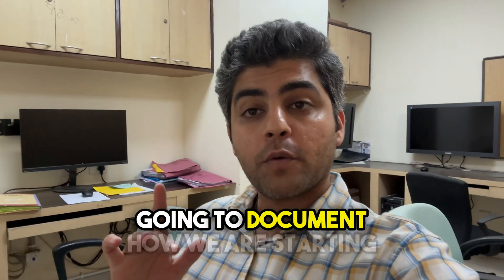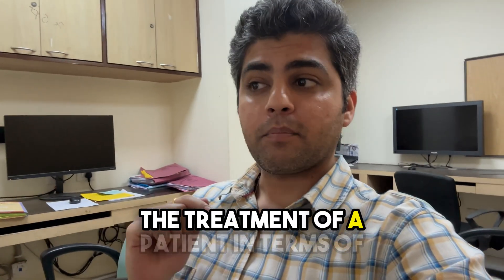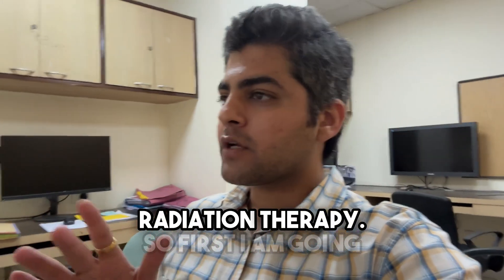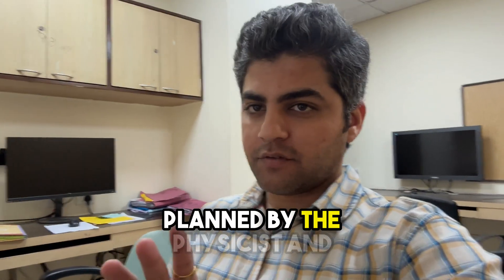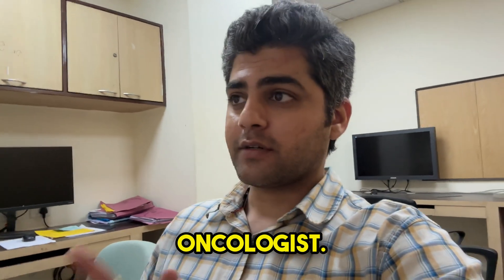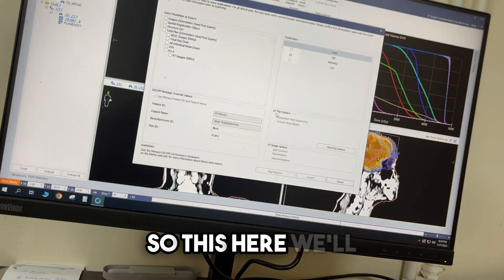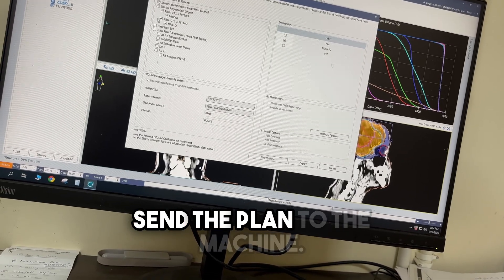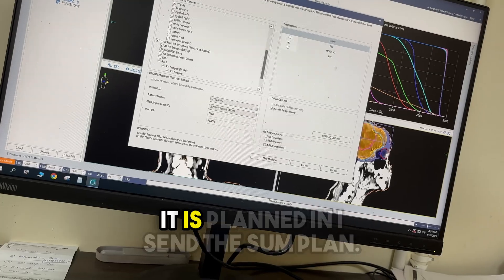Hi guys. In this video we are going to document how we are starting the treatment of a patient in terms of radiation therapy. First I am going to send the plan which has been planned by the physicist and approved by us, the radiation oncologist. So we will send the plan to the machine it is planned in.